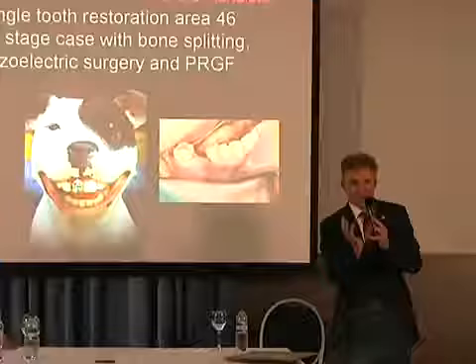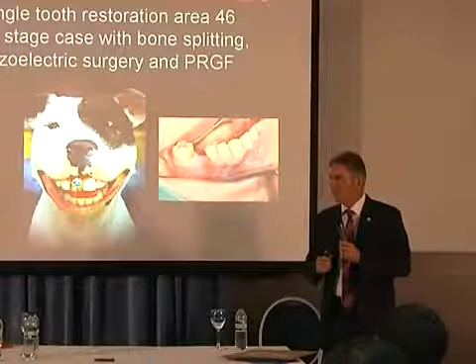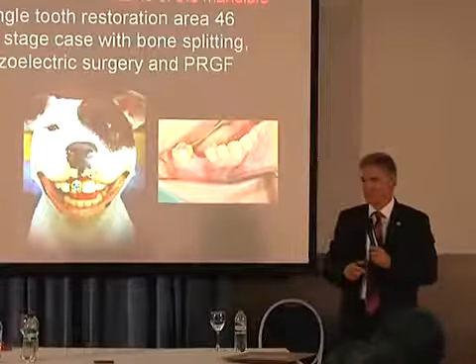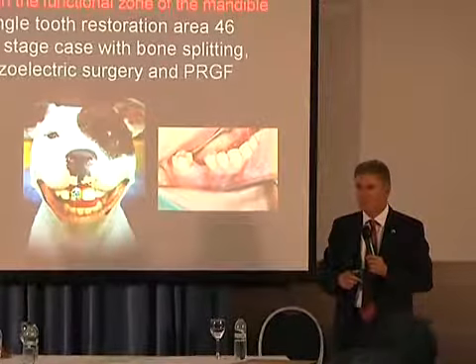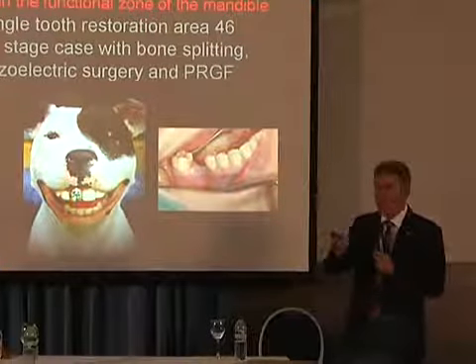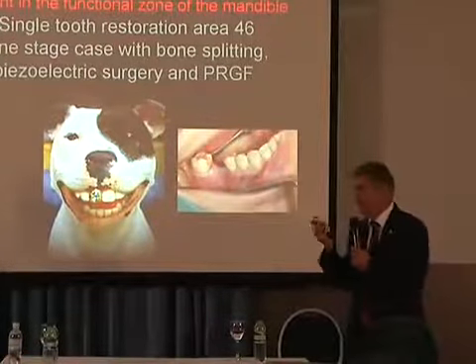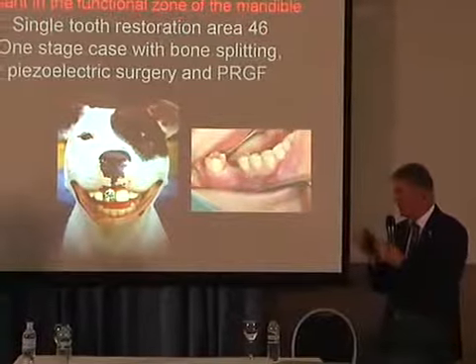On the upper jaw, as you know well, the bone is D3, D4, with more spongy substance and, naturally, softer, and using the splitting technique is easier on the upper jaw. The challenge, you are right, is the central incisor. Here you must take care a lot of the aesthetic outcome. That makes it a little bit difficult. But the technique is in the maxilla more easy.